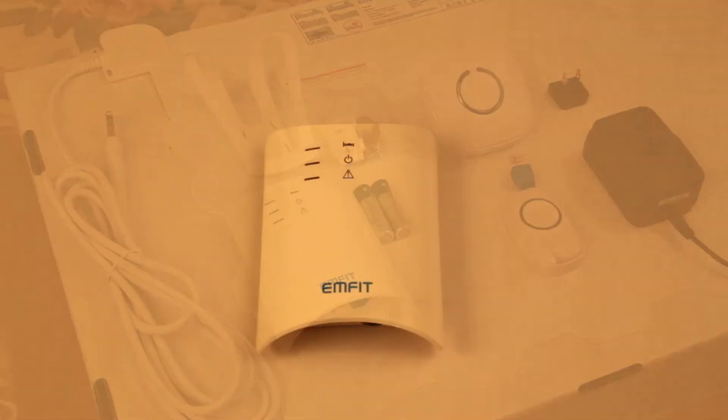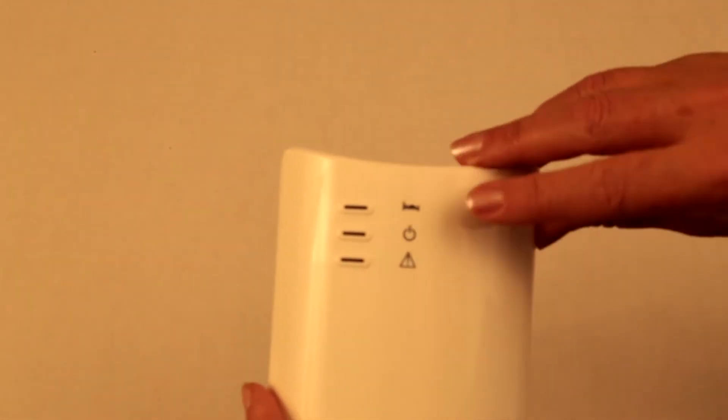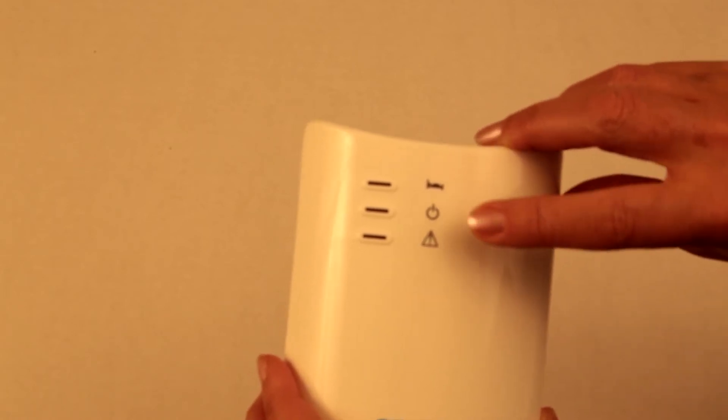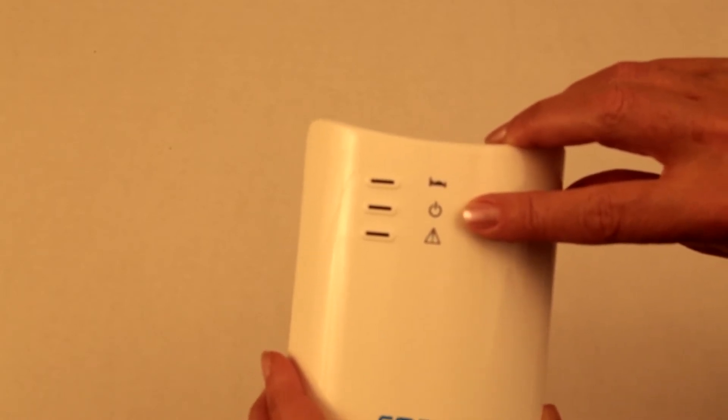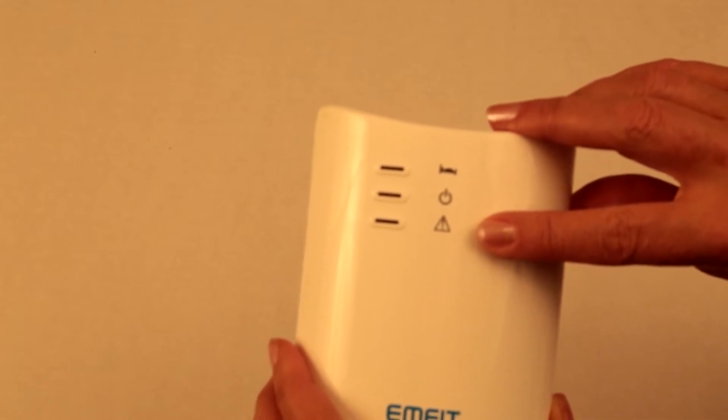The front of the Mfit control unit has a row of three LED light displays. The green light flashing indicates movement activity and presence in the bed. The blue light lets you know that power is on. The red light flashing, along with a distinctive beeping noise, will alert you that battery power is running low.